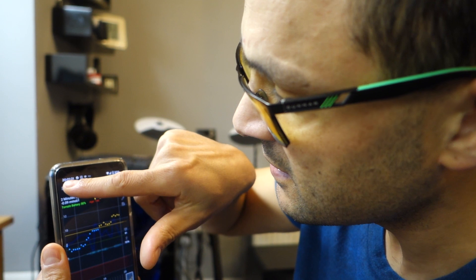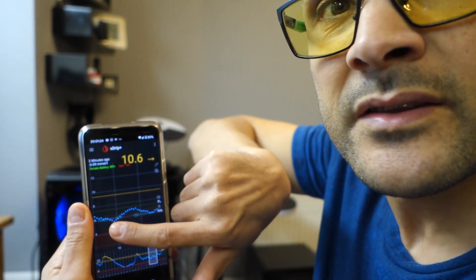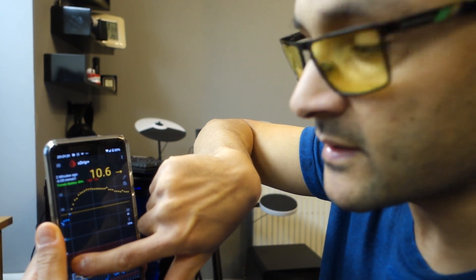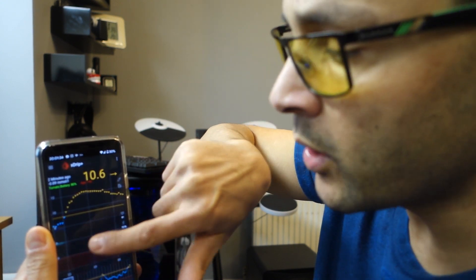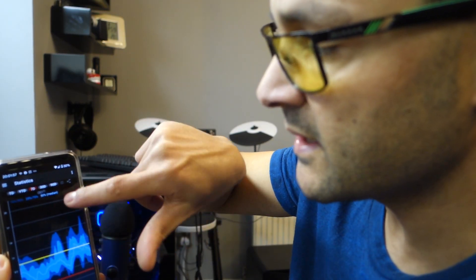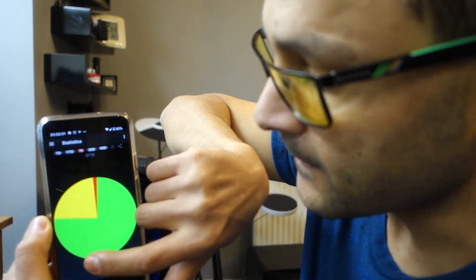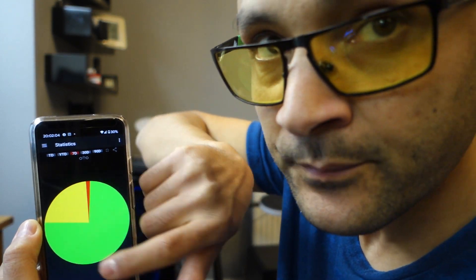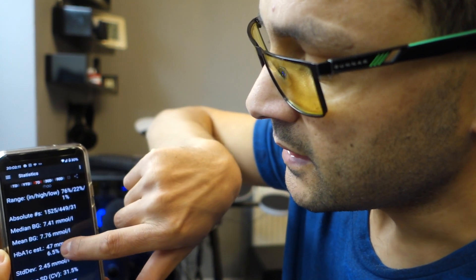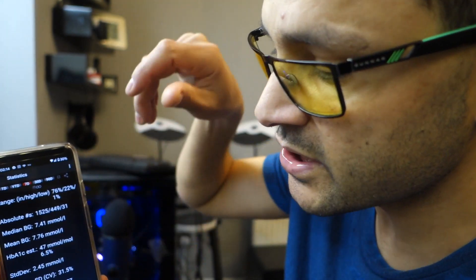My sugar at 10.6 is a little bit high because I just had dinner, but my readings through the day aren't as bad — it does go up and down as you'd expect, and you'd just have to bolus for it. I use the Omnipod. For the last seven days, the green is within 4 to 9, and my HbA1c estimate is 47, which is quite good. I'm happy with that — though when I get a cold it's all over the place.